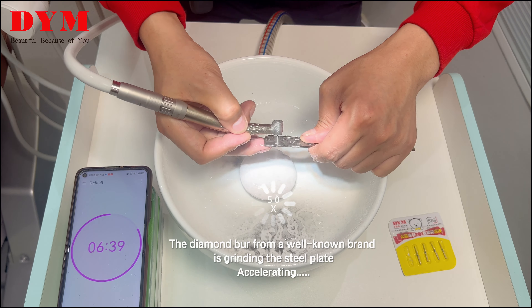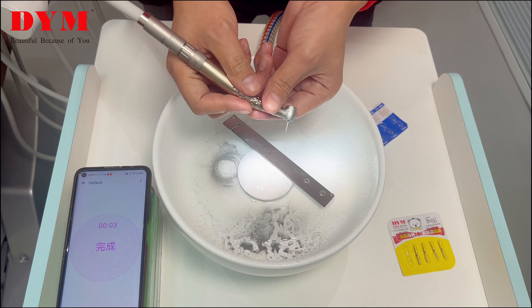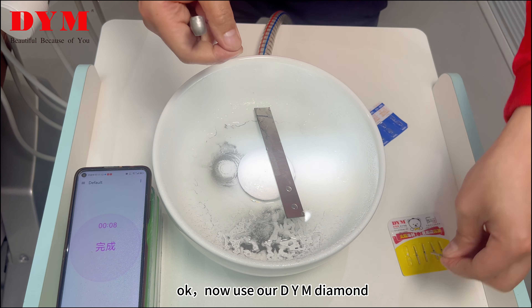This is the DYM golden diamond bar. This is the diamond bar from a well-known international brand. We chose the same model to test — they are all TF12, the same model, for comparison testing.